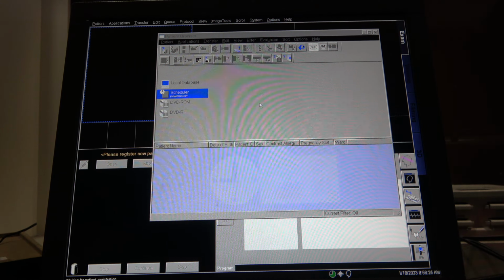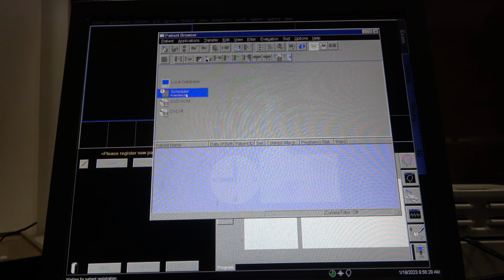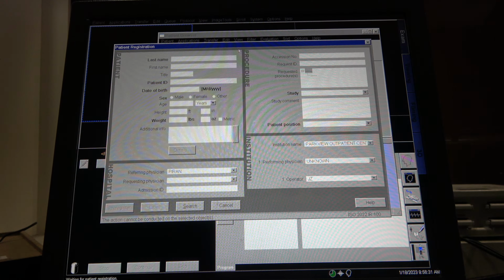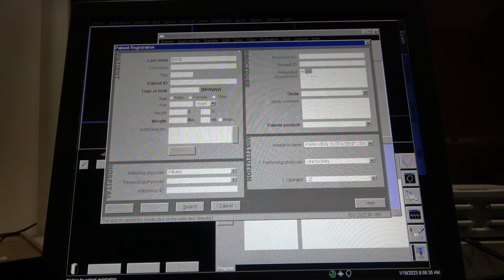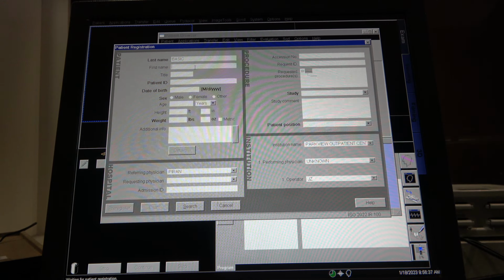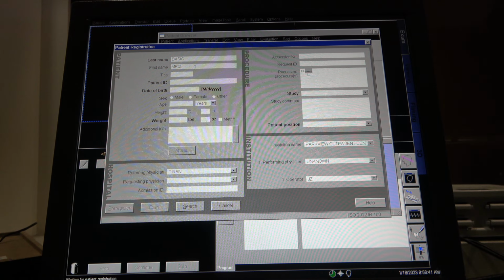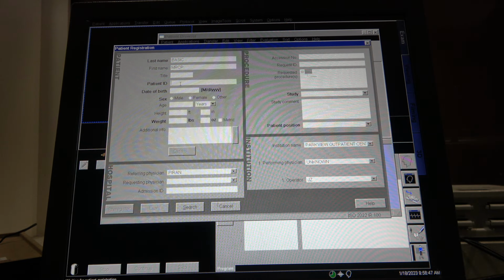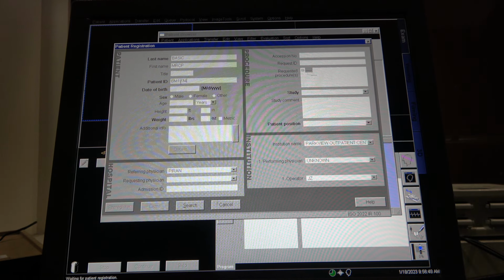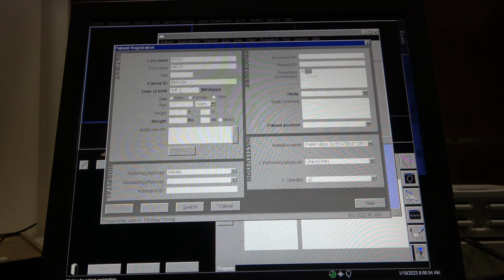All right, here we go. Today we are going to do MRCP. We're gonna look at the common bile duct. And once again, whatever is in bold needs to be filled out with something, anything you want.